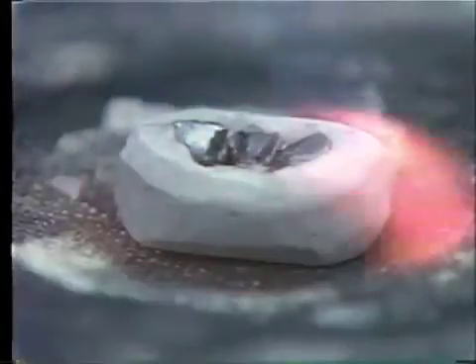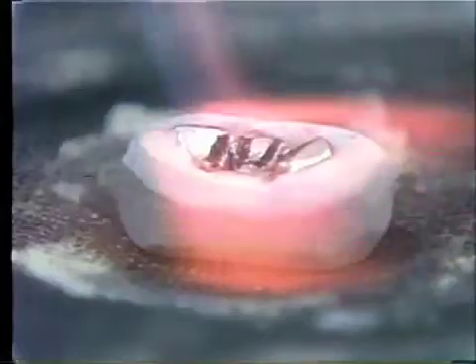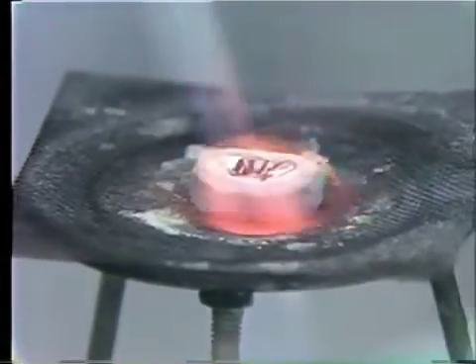One of the problems that students have encountered is placing the antiflux too close to the solder area, which then repels the solder as you try to flow it. Using a brush flame, we're trying to get this as hot and red as possible. As soon as the crowns start glowing, we will be ready to flow the solder on the bridge.